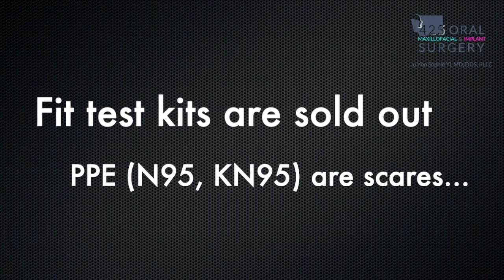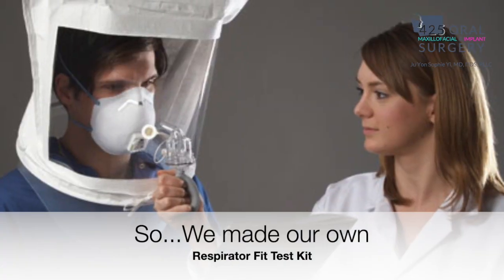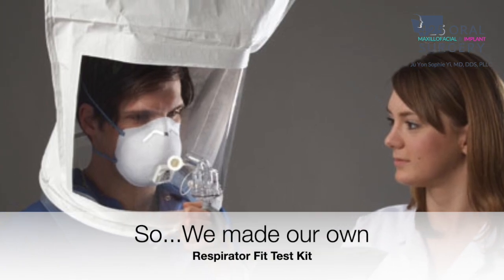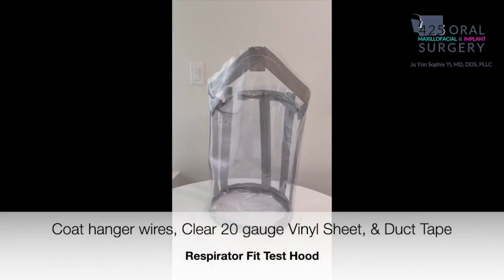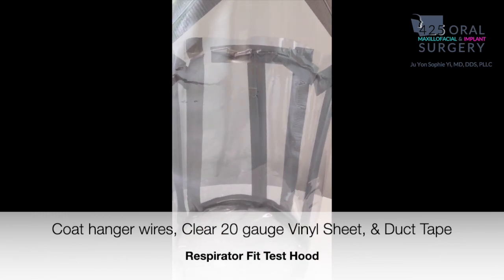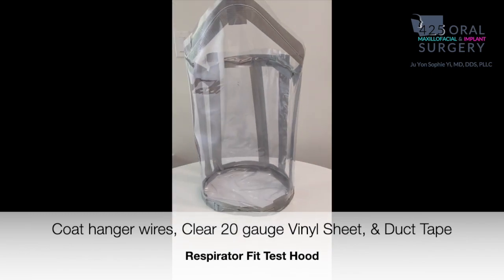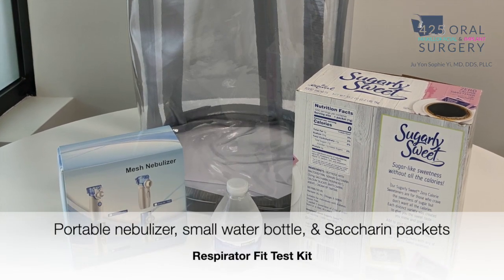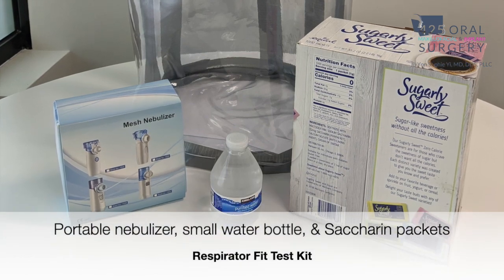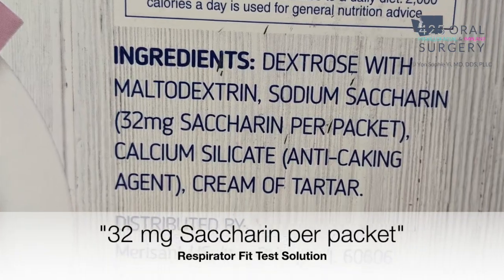However, the fit test kits I was looking for are in shortage and they're also costly, so we decided to make our own as we anticipate going through several different respirators in our office. We made a fit test hood using coat hanger wires, clear 20-gauge vinyl sheet, and duct tape, and got a portable nebulizer.